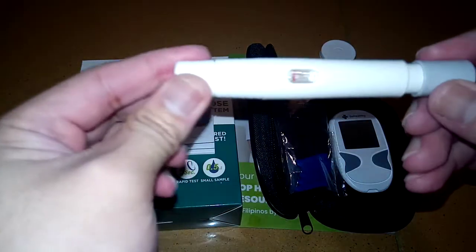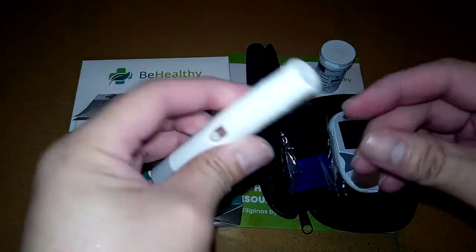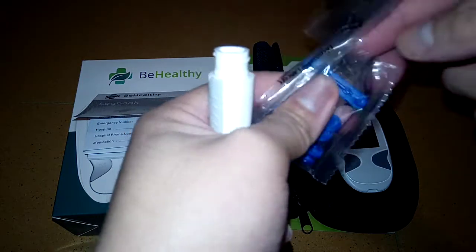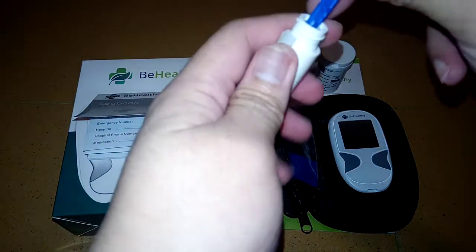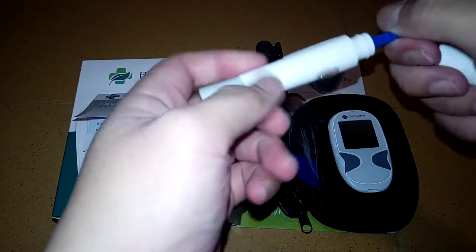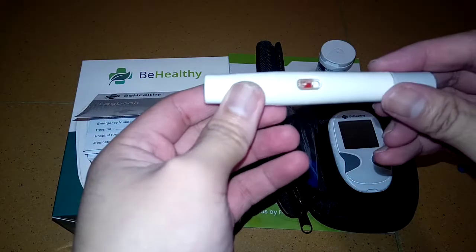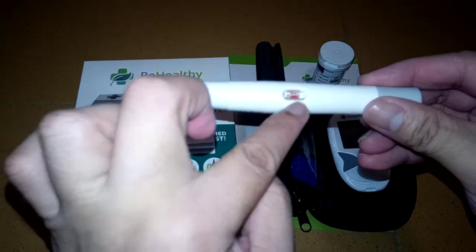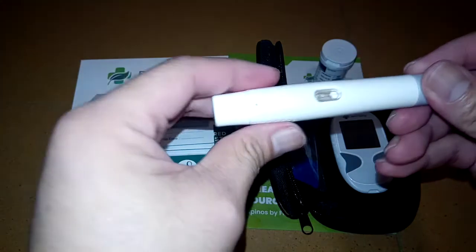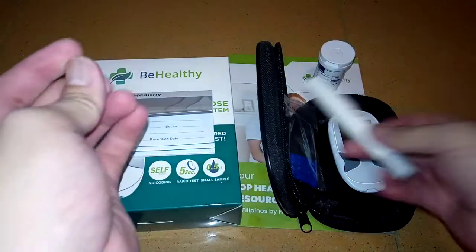I like this pen because you will barely feel the prick when you use it on yourself or your client. You can also tell if the needle is loaded — when you insert the needle, it turns red right away. If you press it and it shows red, it means the lancet is either missing or not yet loaded, so you have to check it.